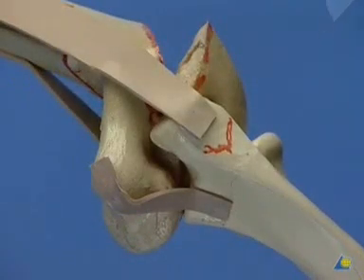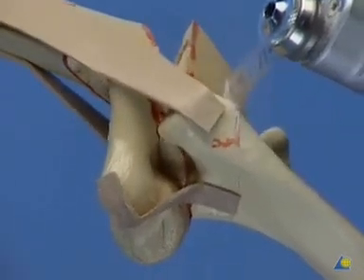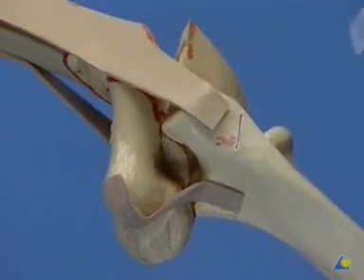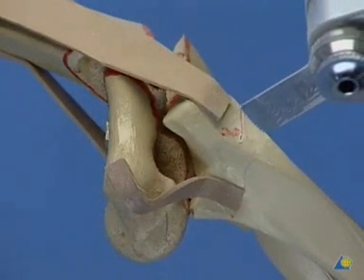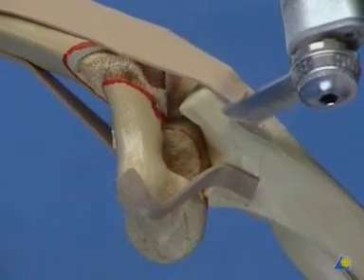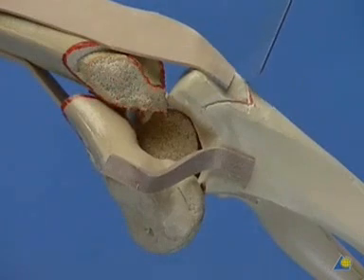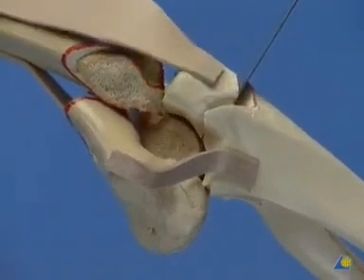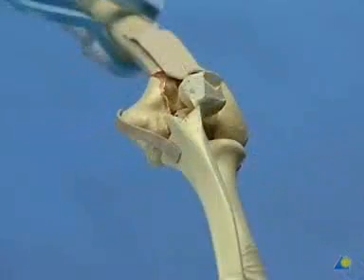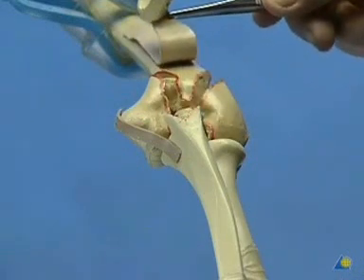Using the oscillating saw, only 4/5 of the bone are cut. The final bit is broken off with a chisel, and the olecranon is reflected proximally. With the fracture situation assessed and the bone surfaces cleared of hematoma, the reconstruction may start.